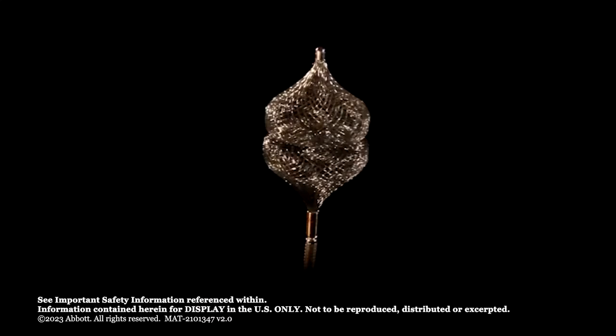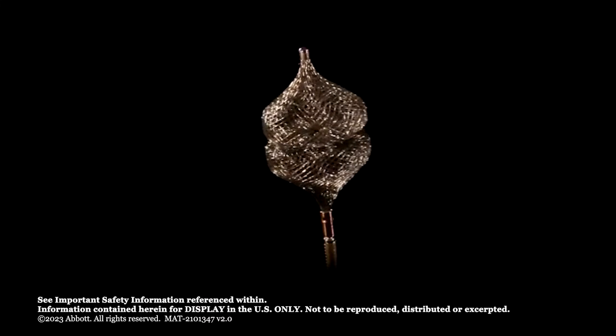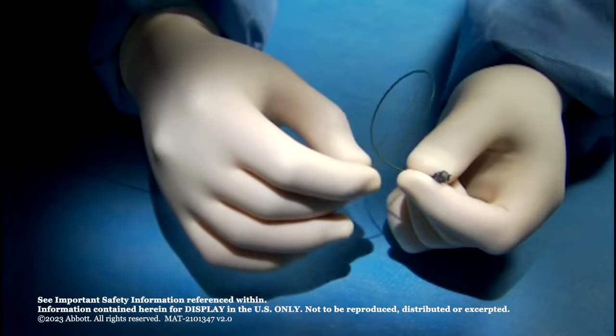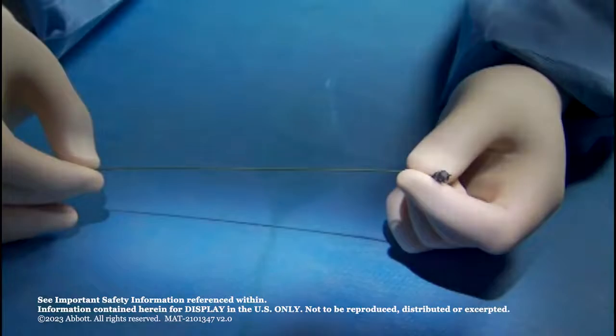The Amplatzer Vascular Plug 4 is ideal for embolization procedures, particularly through tortuous vasculature and in distal anatomy. The delivery wire is designed with a floppy 20 cm distal section to allow it to track easily through tortuous anatomy.